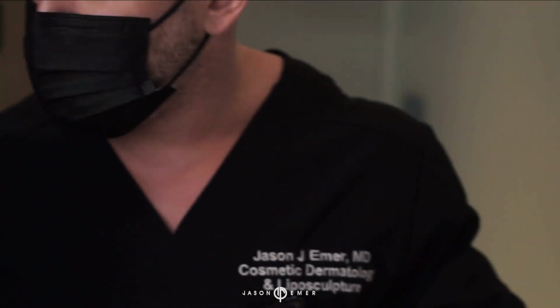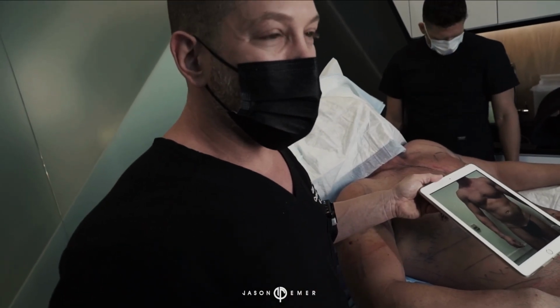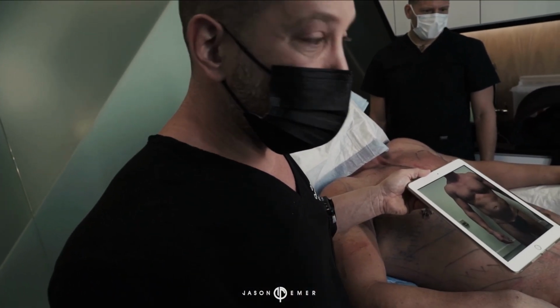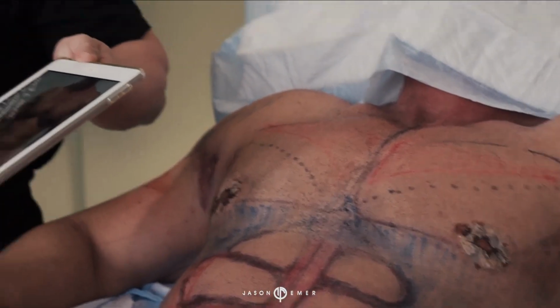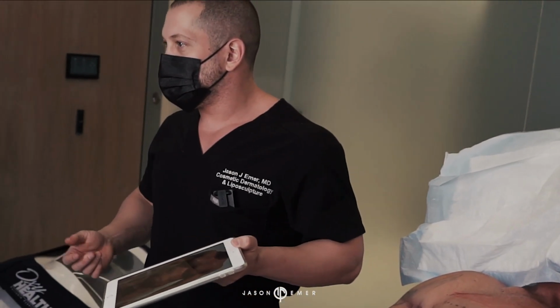This will take us a few months to really see the results, but within a week, he's really going to notice this a lot, especially the first 72 hours. It's going to be super swollen, not much definition, and then all of a sudden it's going to start to show. All right, so that's really it, day one. I like to show that because I know you guys like to see how the patients are.